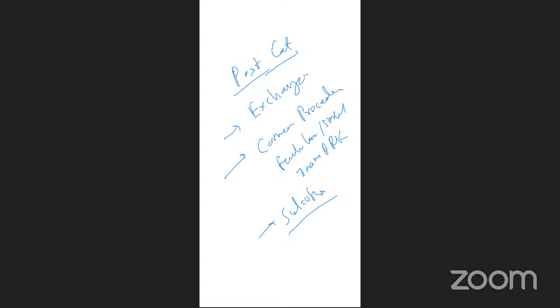After 2 or 3 months, if the error is very high, then the choice of surgery is to implant another IOL only, in the sulcus. If it is only refractive surprise or refractive error, then using a sulcus IOL is an easier and better option. But if it is intolerance to the lens, then IOL exchange has to be done.